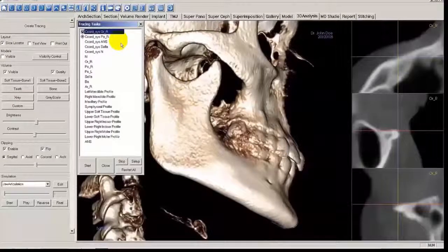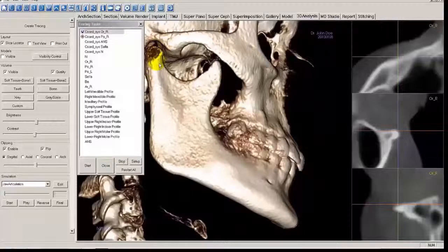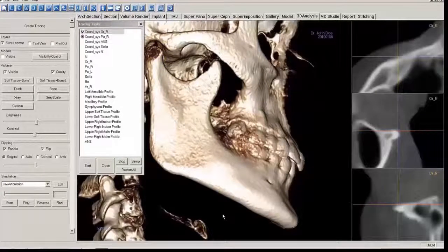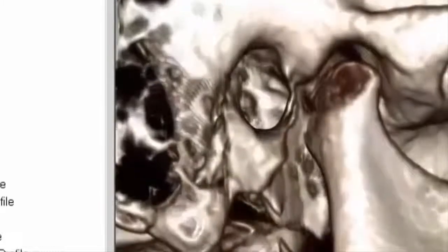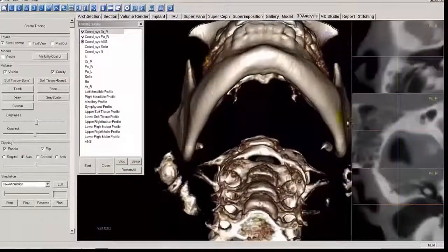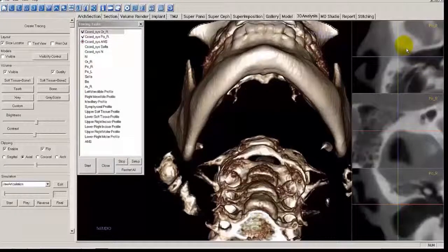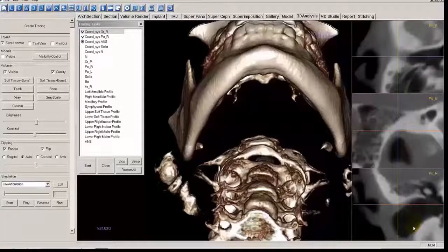We've advanced to Porion Right. The condyle is sitting in the fossa, so we need to go further posterior. Hold Shift and the left mouse button to pan out, and tilt up a little to better see where to place the point. Left-mouse click at the uppermost point of the porion. The top slice is the axial view, the middle is the sagittal view from the side, and the bottom is the coronal view looking straight ahead at the patient. We now have the Anterior Nasal Spine — ANS — the most anterior point of the maxilla.